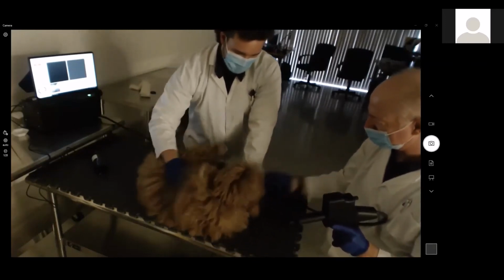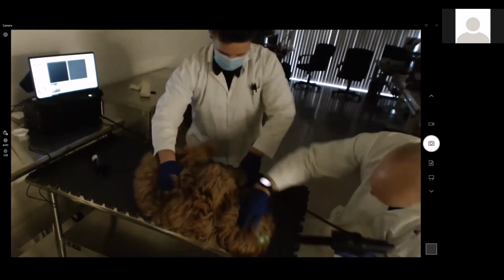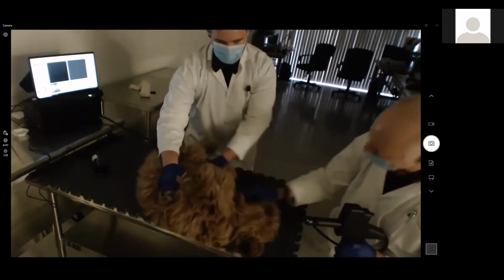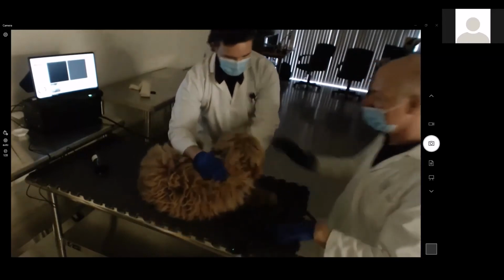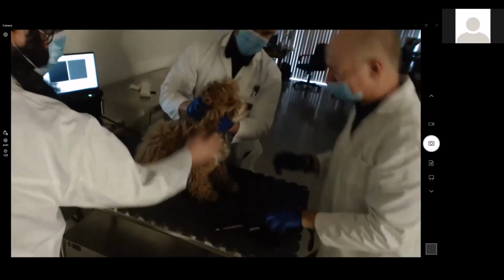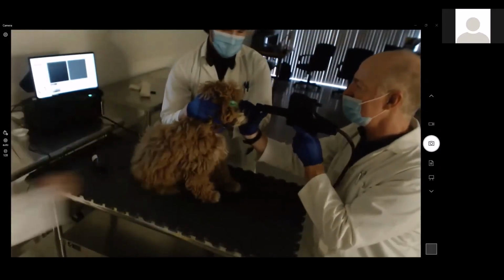Yeah, you're doing pretty good, man. Good boy, you are being fussy. Okay, I need you to hold. Do me a favor, Trenton, I'd like you to hold him up here. Just hold his head still like this. Yeah, there you go. I'll just run his nose and his eyes.